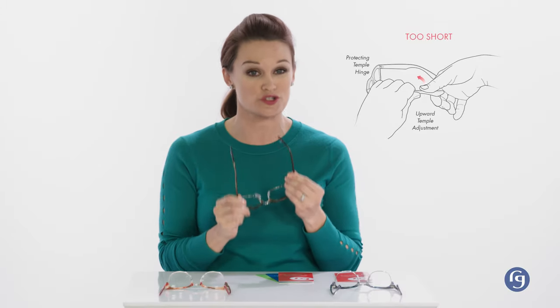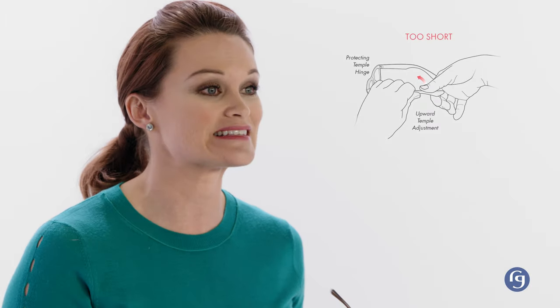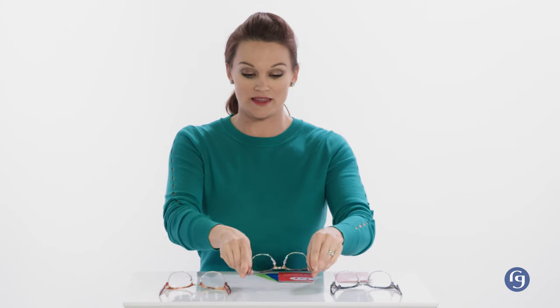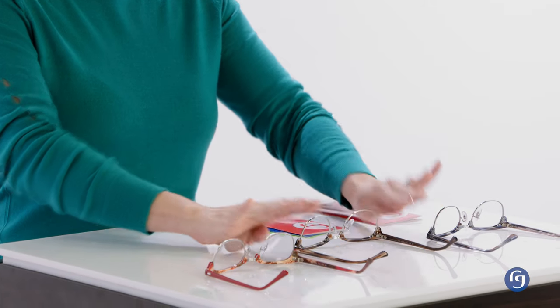The inverse of the slipping problem is when the curve of the temple arm is adjusted too short. This can cause two problems: discomfort around your ear and glasses that don't sit at the proper angle. If your glasses look like this, just modify the bend over the ear to lessen the curve. Do it in small increments until they feel right, and then always align with that 4-point alignment you learned earlier.